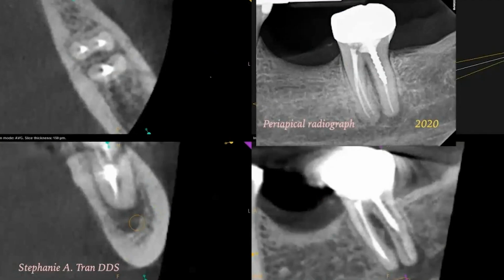Now, again, we want to keep in mind that these thin areas or these J-shaped lesions have to be in line with existing clinical findings, and it's not an automatic decision just from a CBCT. So in this case, this is that previous case that I'd shown as an example of beam hardening.